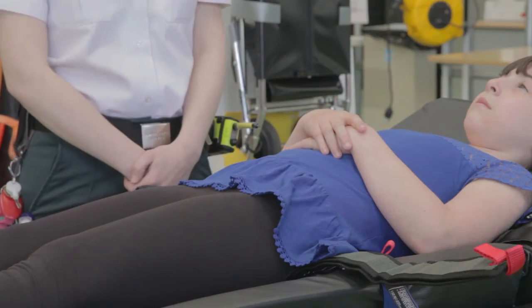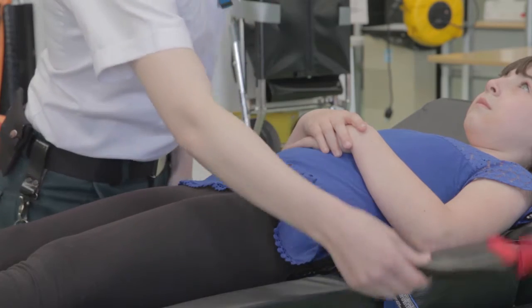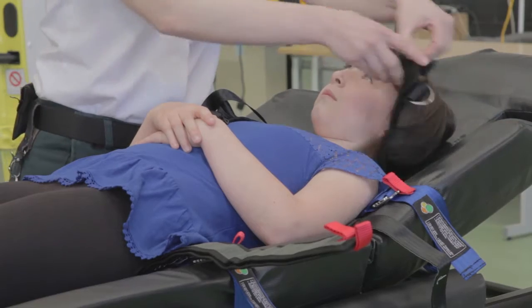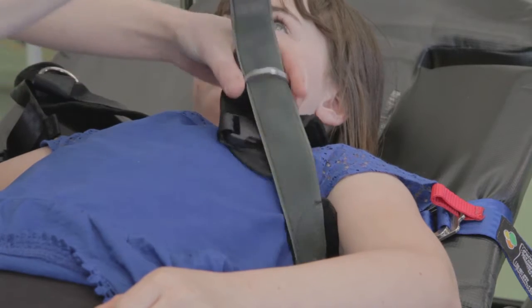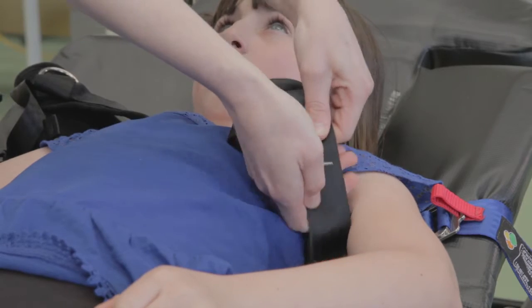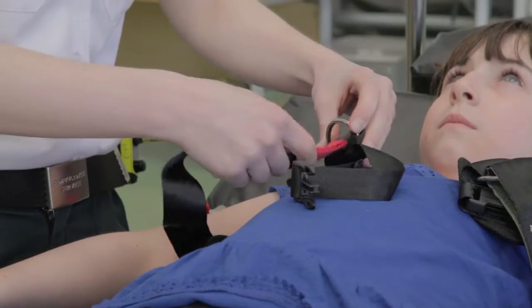When positioning the child on the stretcher, ensure that the child's waist is level with the waistband. Now bring the shoulder straps over the child's shoulders. Feed the red tab on the arm strap through the D-ring and secure the hook and loop against the strap below. Firmly press together, ensuring the white marker has cleared the D-ring for maximum engagement.